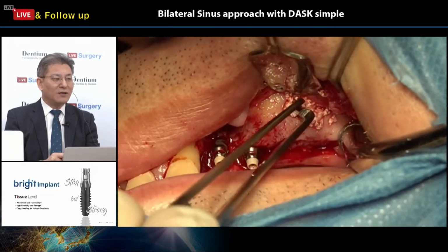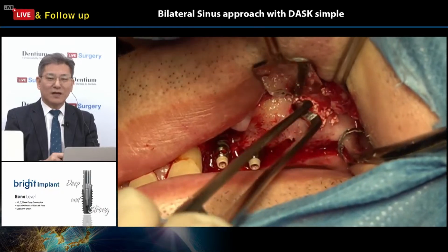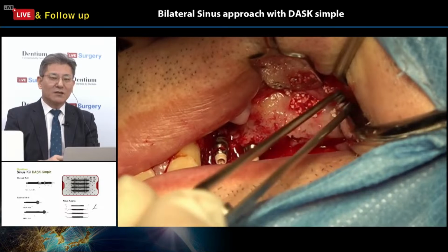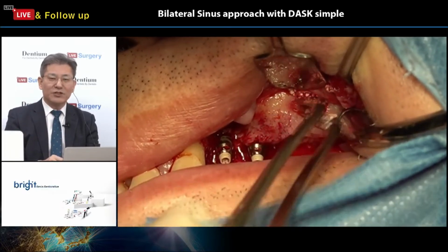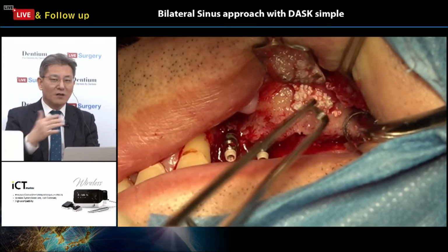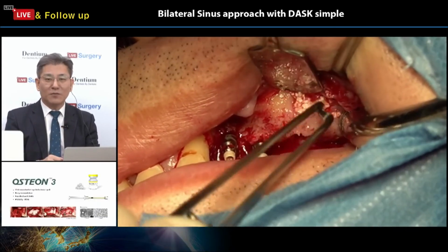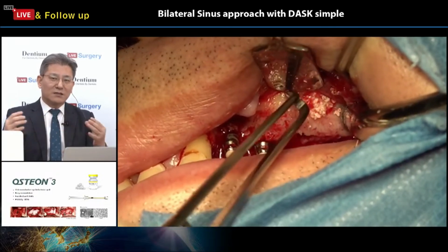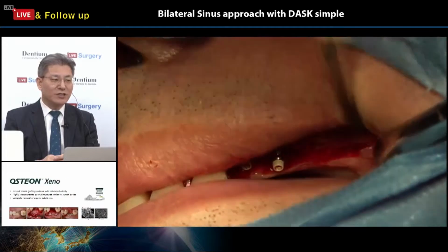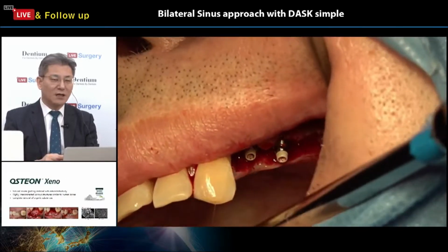It basically depends on the sinus cavity. The bone graft material's volume is so different. However, the standard bone graft material's volume for two implantations with the lateral approach, with about 3 millimeter of remnant bone, a minimum of 2.0 cc of bone graft material should be prepared. Okay.